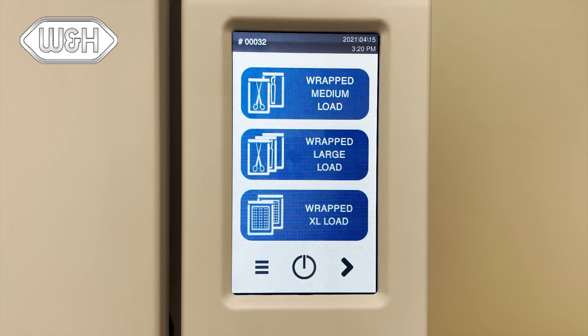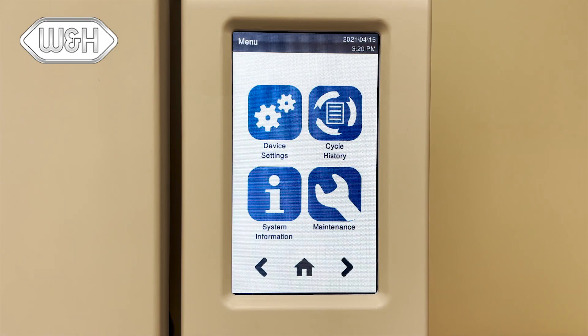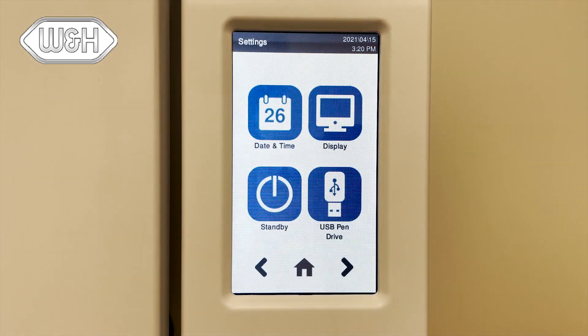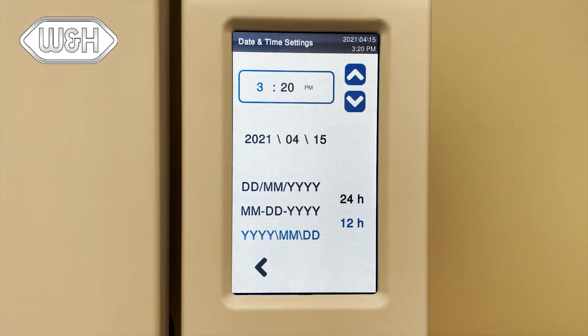There are several settings you should confirm before using the Lexus sterilizer. First, the date and time. On the home page, press the menu button, then press device settings, then date and time. You can then adjust the date and time by simply touching the month, day, and year to the desired date. Press the check mark to confirm your settings.